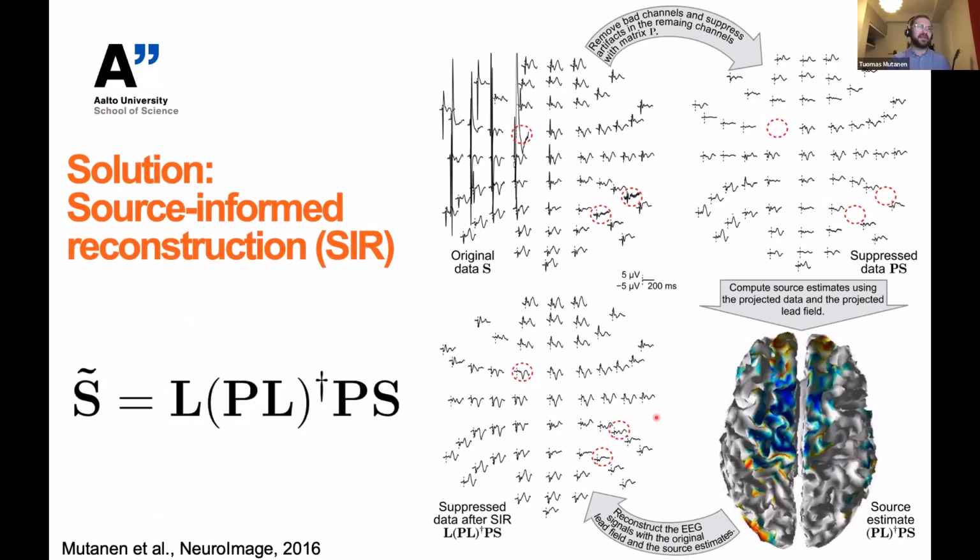And this is just to highlight that this whole process, you can just write it with one equation. So this would be obviously very simple for anybody to program in MATLAB once you have calculated the lead field or the forward model for your EEG.